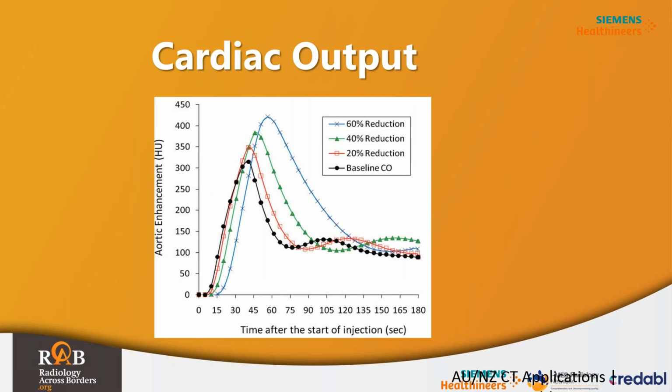Cardiac output is another important thing to consider. If you've got a really old patient with a really poor cardiac output, all the timings that we discussed, or the phases, will be pushed out, and vice versa.